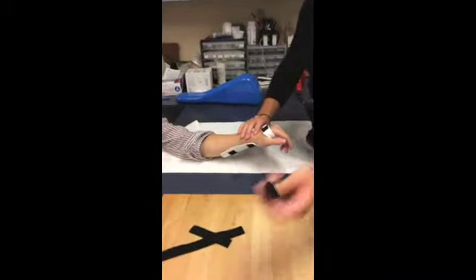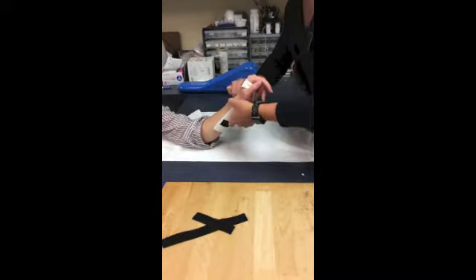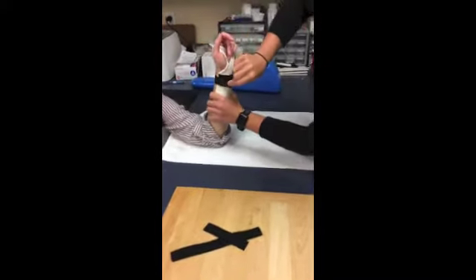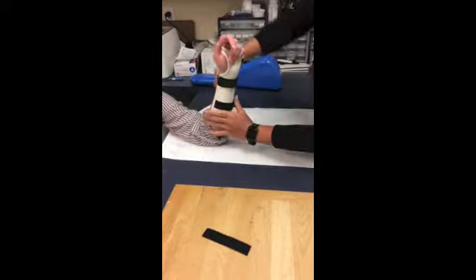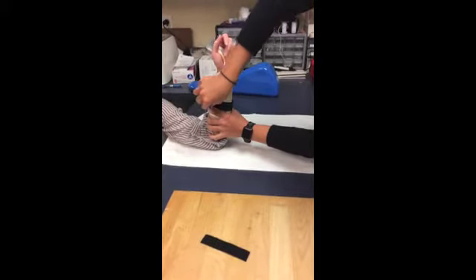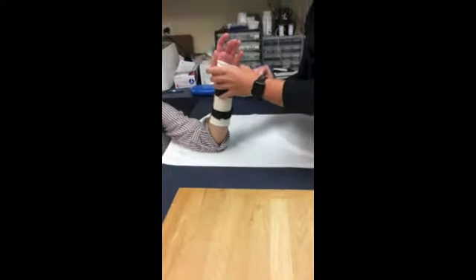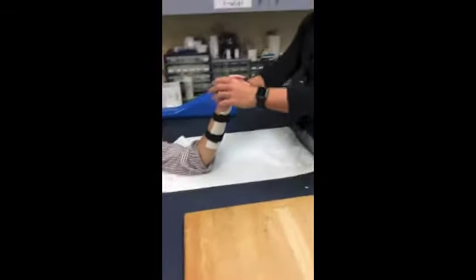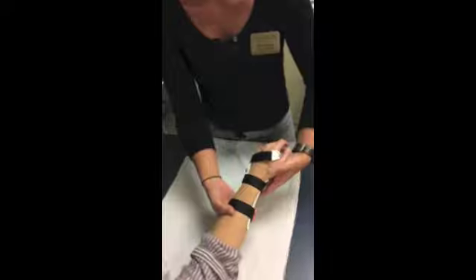Next, apply the loose velcro. Make sure it's nice and tight around the patient. Apply pressure to allow the other one to secure. And it's done.